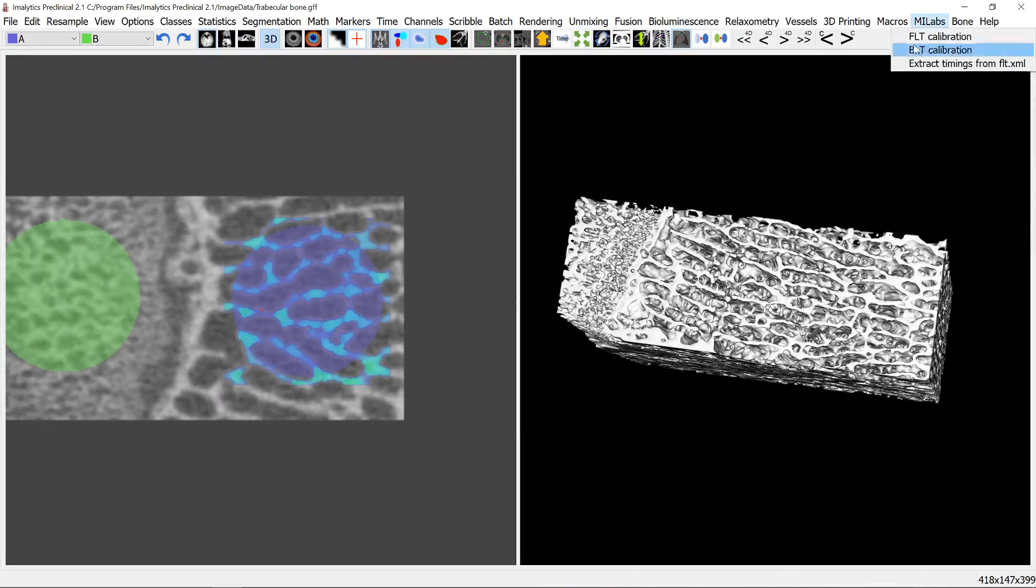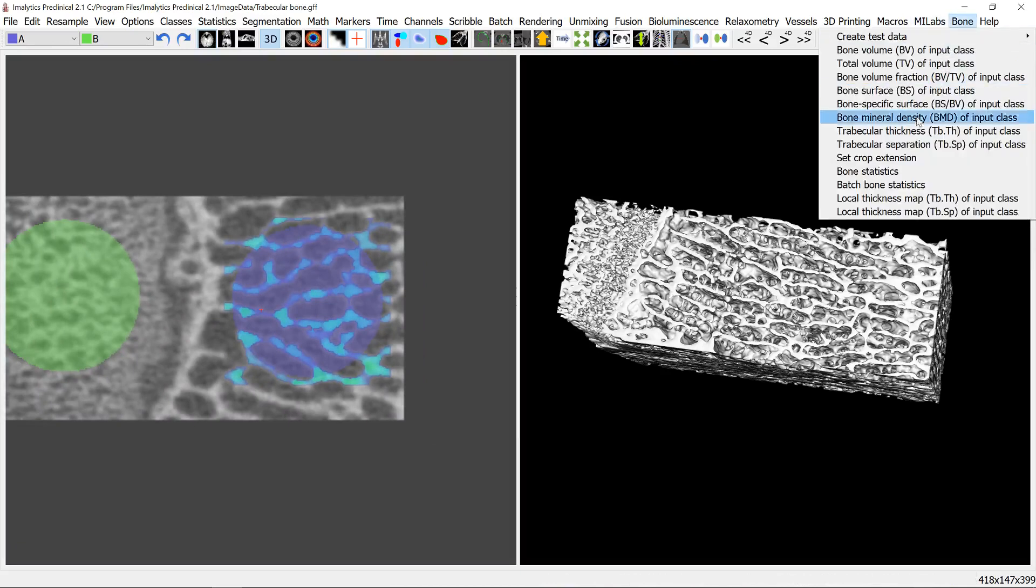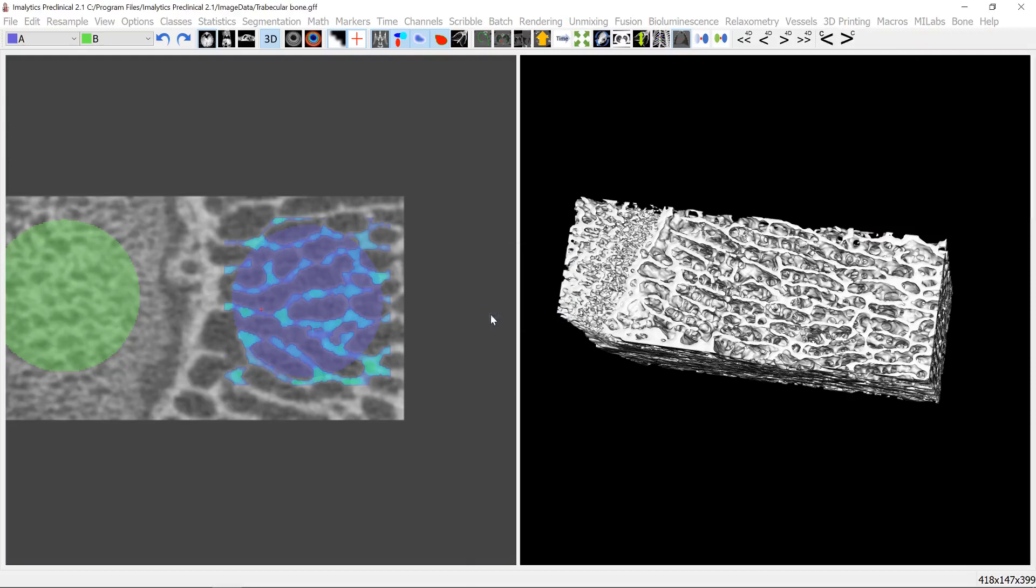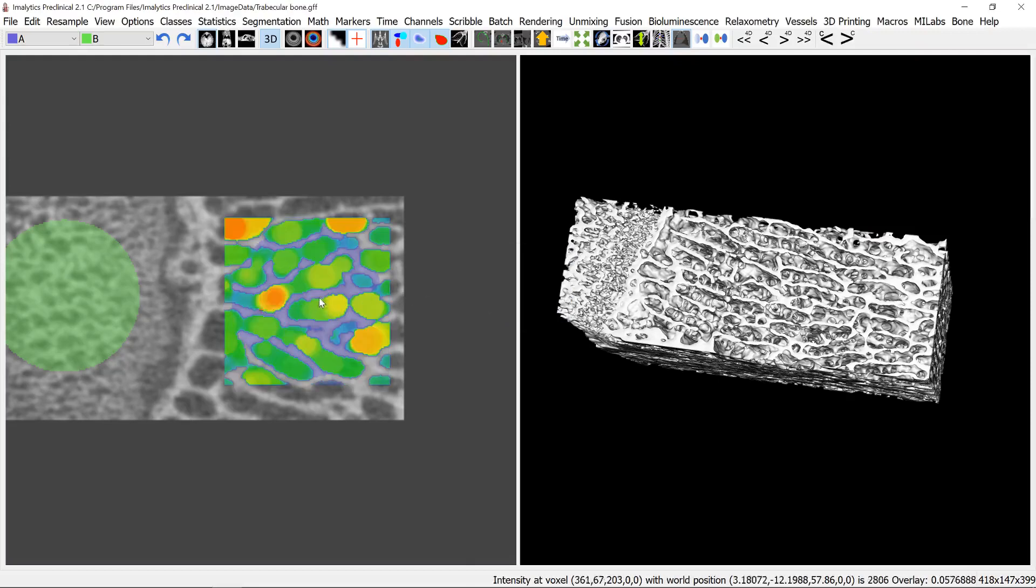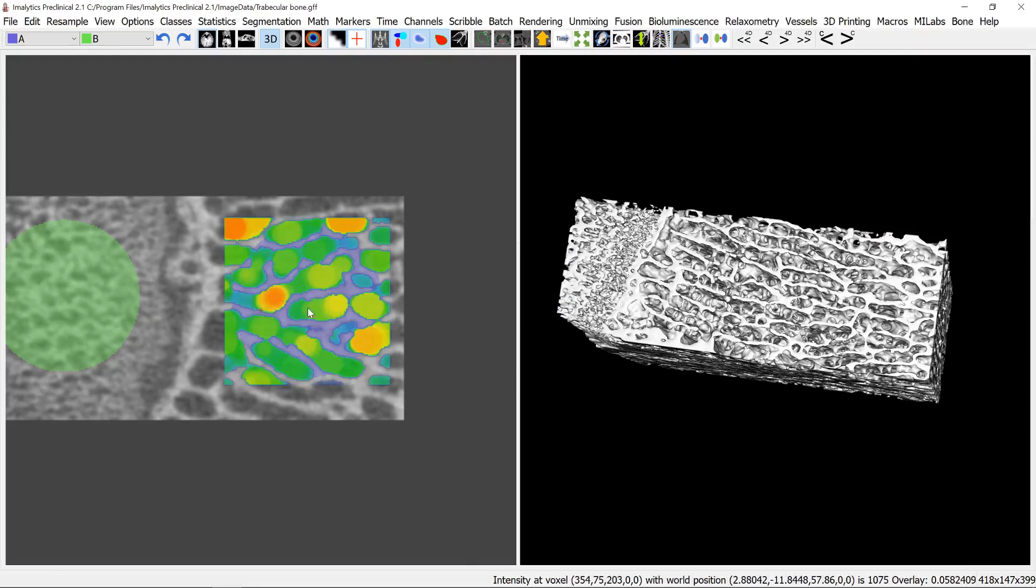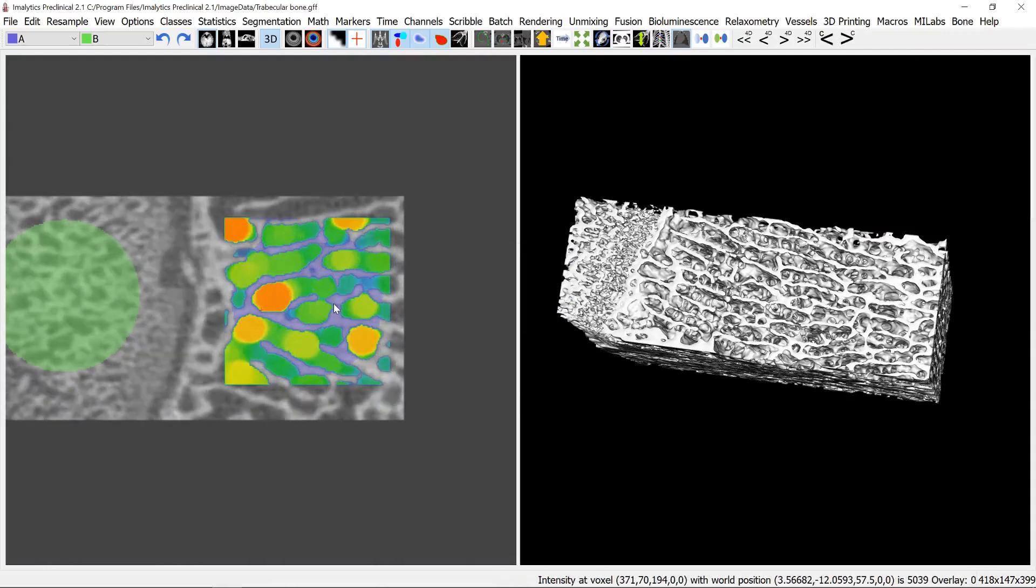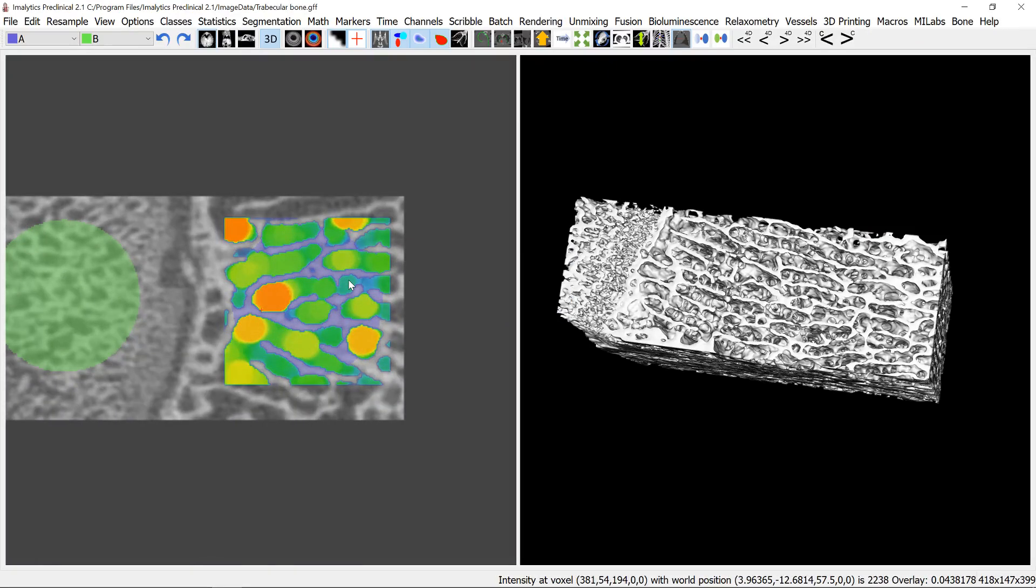And in a similar way we can compute the local thickness map of the trabecular spacing, and then it's fitting these spheres into the spacing and computing then the mean of that. And that is the same how BoneJ does it and we compared the software also against BoneJ and it correlates very nicely.